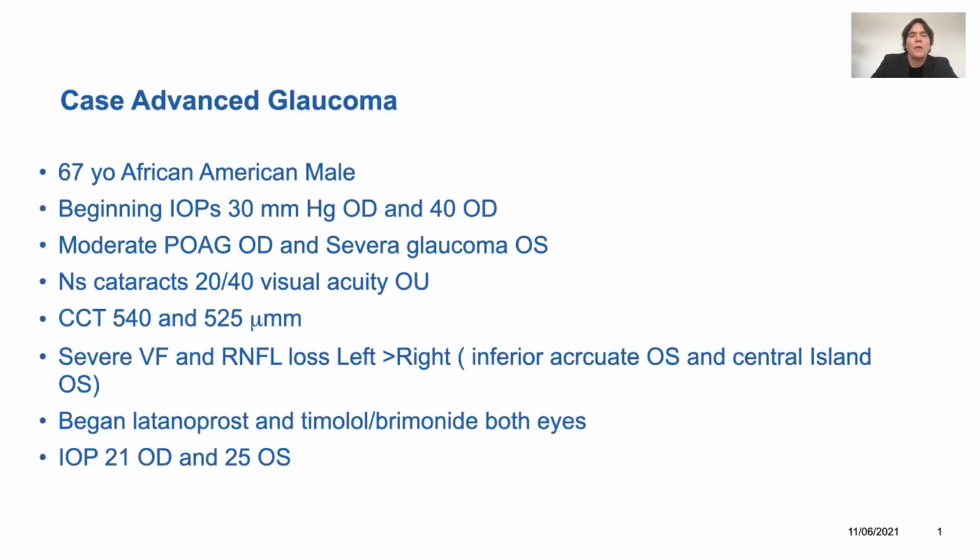Okay. So my patient doesn't have as long a history in the practice. He's one of these who just kind of showed up with high pressures and decreased vision. And he had some cataracts. So we took out the cataracts, did MIGS surgery, got him started on some drops, with marginal control. So with eye drops, we put him on a couple, and this is all very fast moving over the course of weeks.